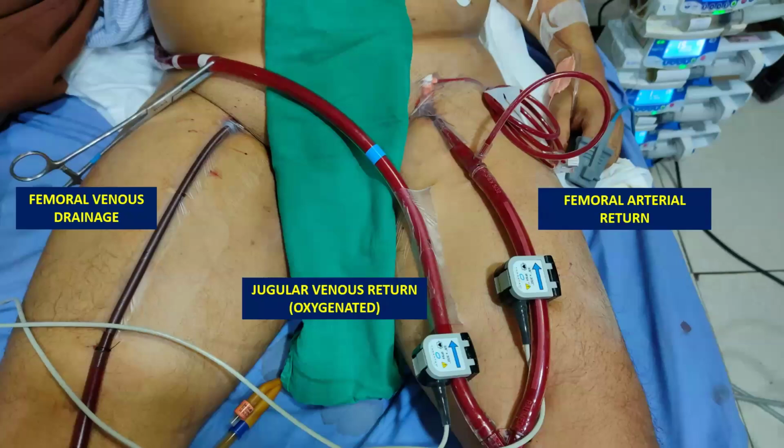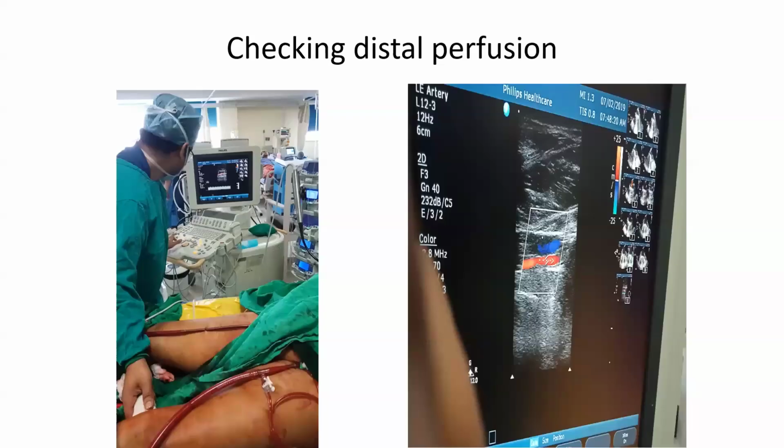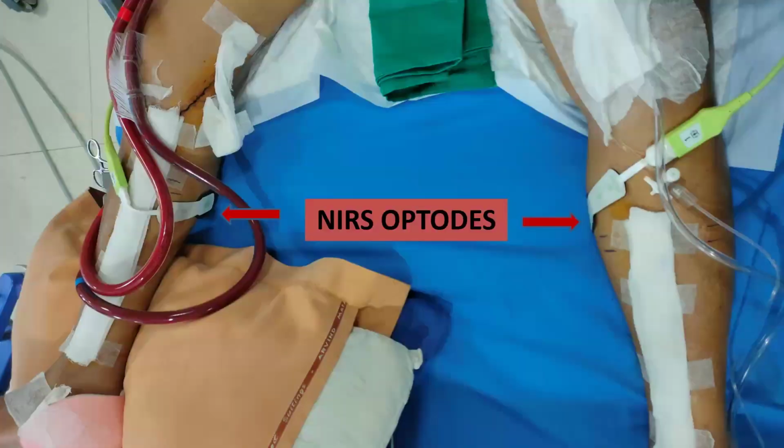So if you have a VA ECMO, always check the distal perfusion in the limb by checking the flow in the popliteal vessels. Popliteal artery flow, if it is adequate, the limb blood flow is adequate. If you have NIRS optodes, you connect and see the oximetry difference between the two, and it will give the earliest indication of any limb ischemia occurring.